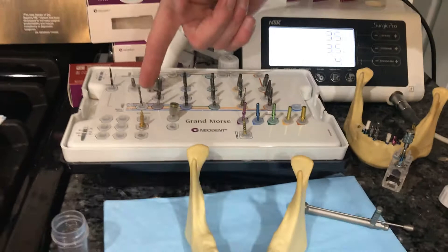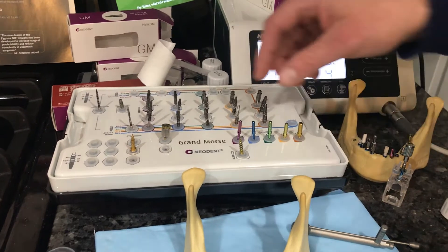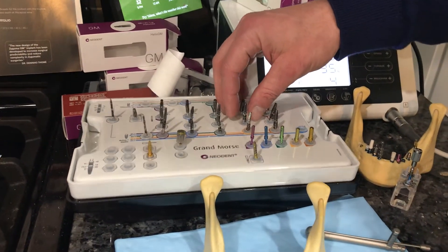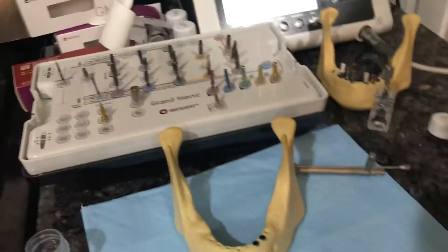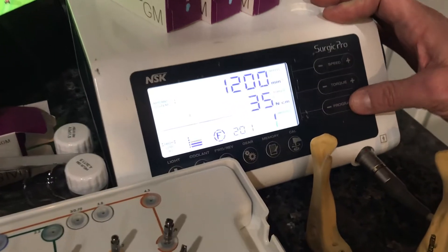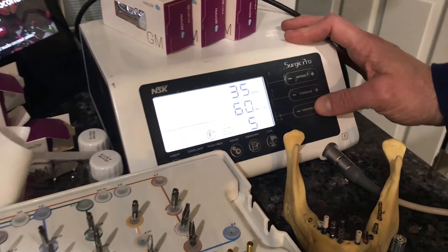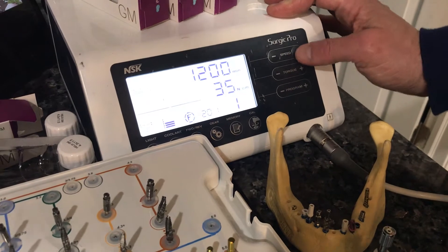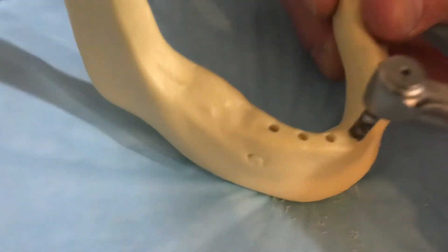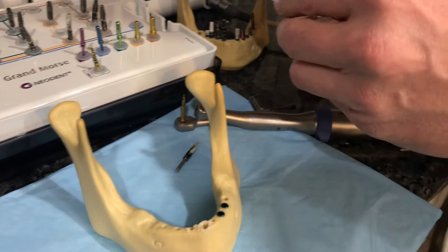There's a second option in the kit: the second row has what are called plus drills. These are contour drills — slightly wider — that allow you to prepare the osteotomy a little bit more in the event the bone is too tight. I change my program back to 800 RPMs and use the plus drill, which is almost like a bone tap, to widen the site. Then we can go back in and place the implant.